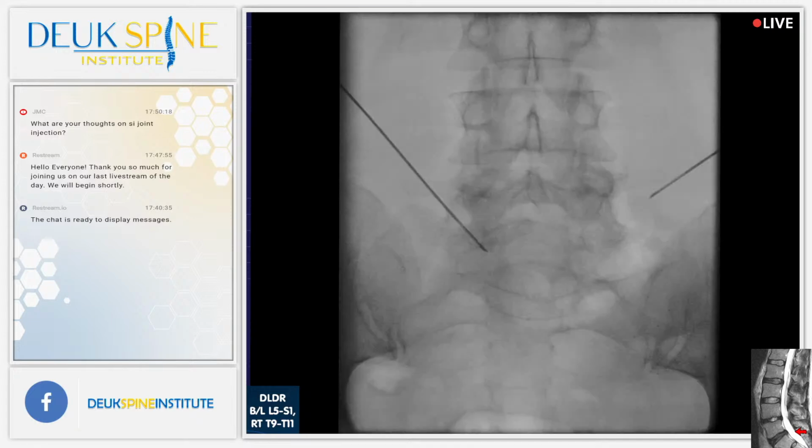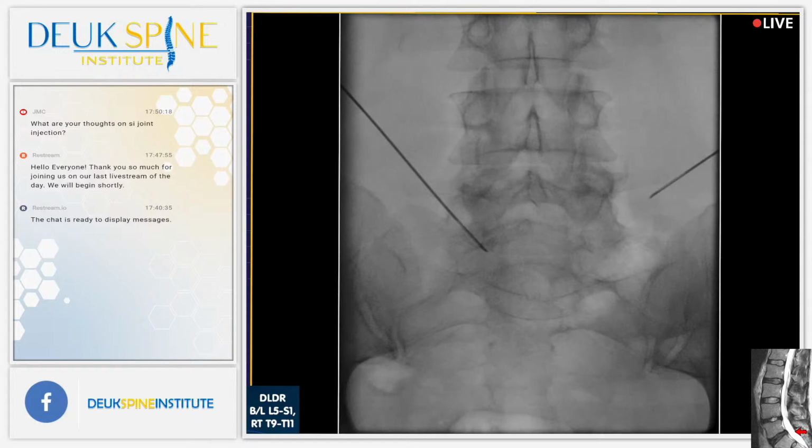You never know how difficult it's going to be to get into somebody's spine. Oh yeah, show them the pedicle of 5. So show them the pedicle of 4. Go up. That's the pedicle of 4. It's perfect. Go to the other side. Perfect. The one above. Perfect. And then look at 5. Weird. And then look at the other side. Really weird. Okay? Totally abnormal.